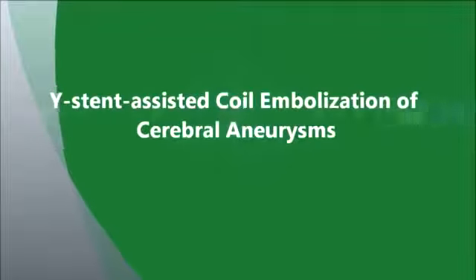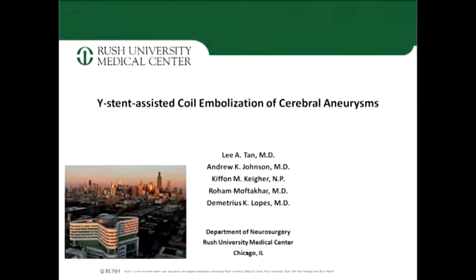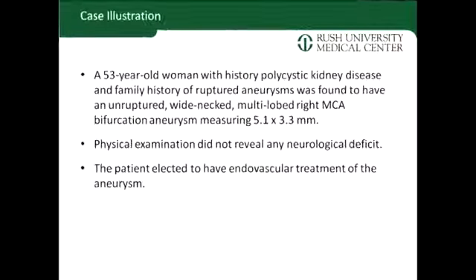We'll present our stent assisted coil embolization of a middle cerebral artery aneurysm. This technique we first described in 2005 in Neurosurgery, and since then it has been more widely used for the treatment of middle cerebral artery aneurysms. This technique was ideal for this patient.